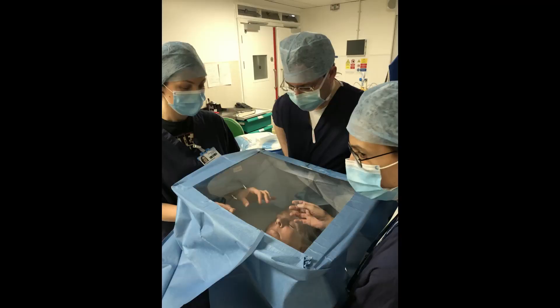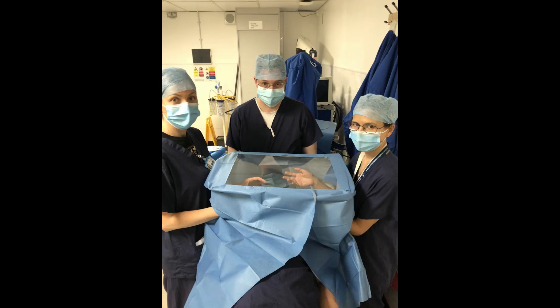This is the setup with three team members, showing comfortable access for two surgeons and the anaesthetist.